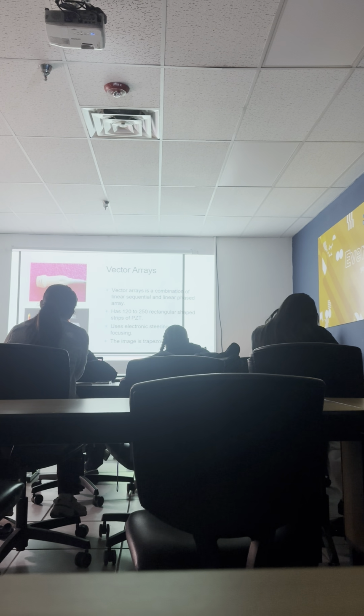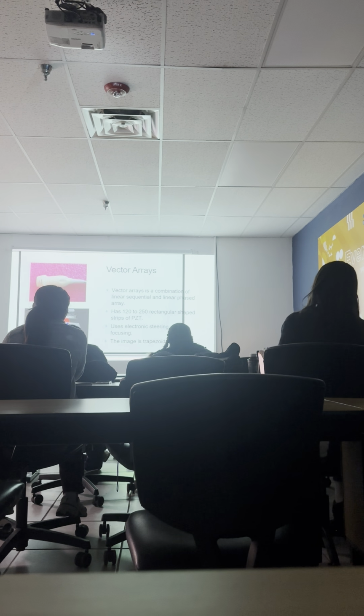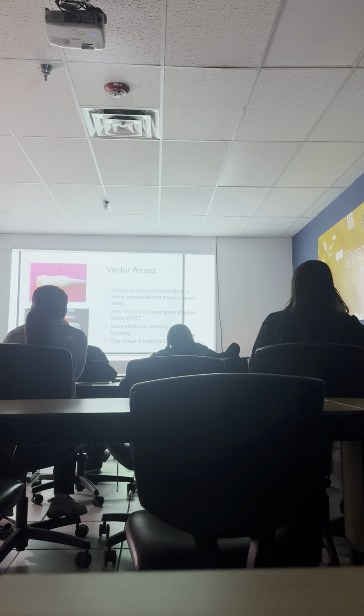So this is a combination of both. Where do we use this type of transducer? The heart, for echoes. We use this for transcranial Doppler to the head, and we also use this for the neonatal head.